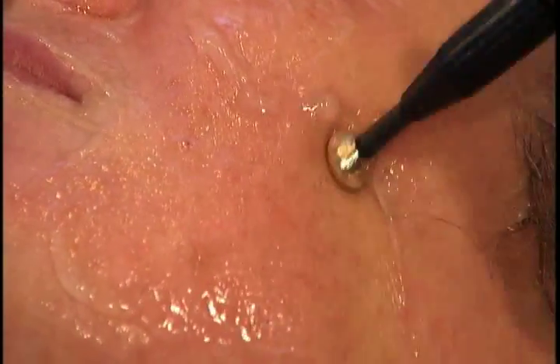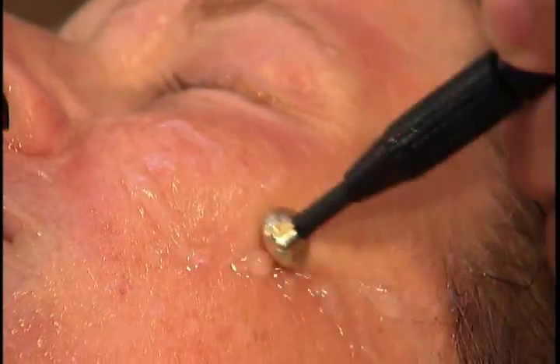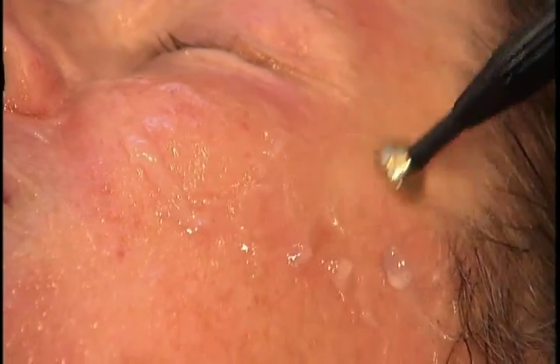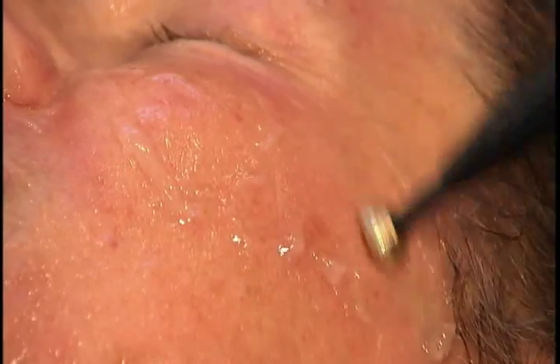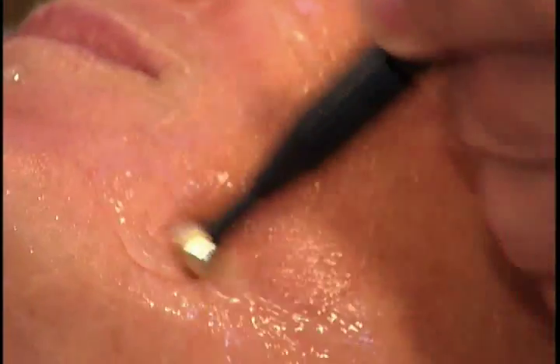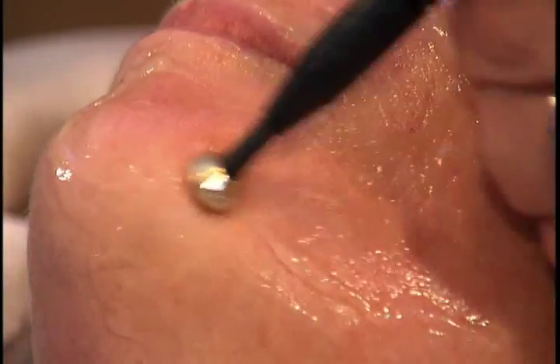And then I work this J-shaped area where we're really going to emphasize the contraction and push her malar prominence up. She's got some volume loss laterally that's caused flattening here, but she's got some really nice volume medially, so we want to take advantage of that and try to get it back up where it used to be.